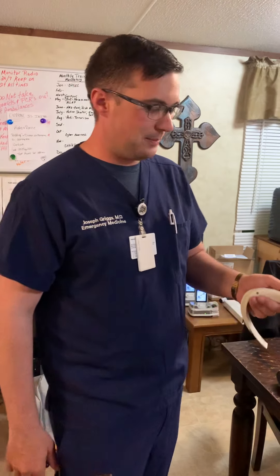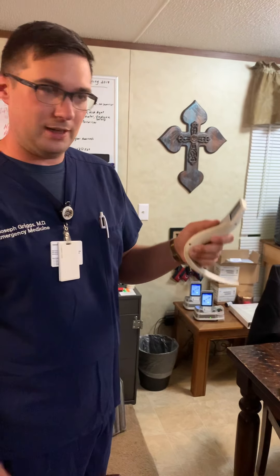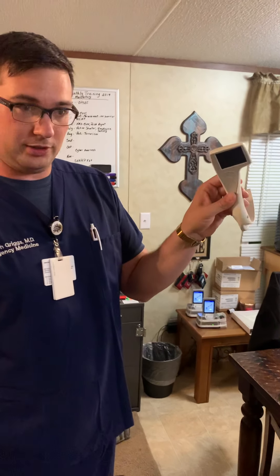Hey everybody. So for the next week, I'm going to have a mannequin head and a video laryngoscope down here at the trailer for everybody to try and see if you like it.